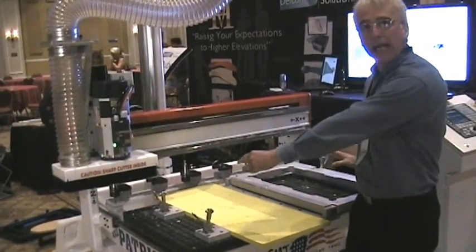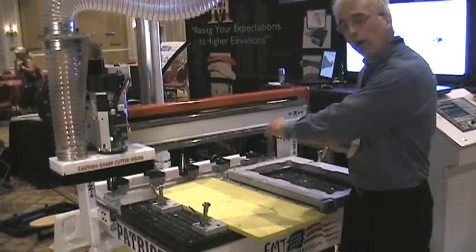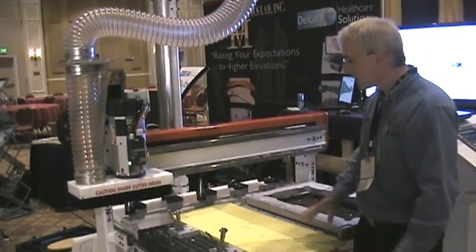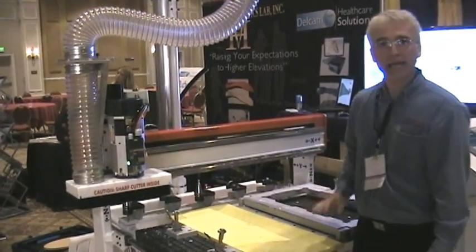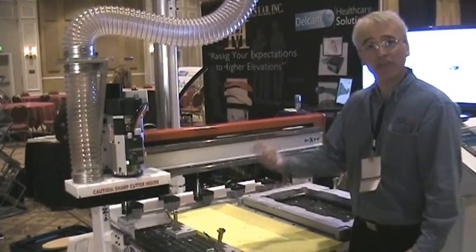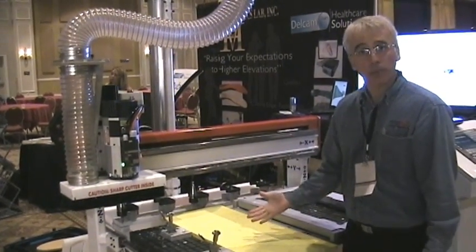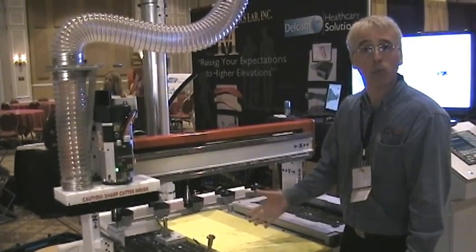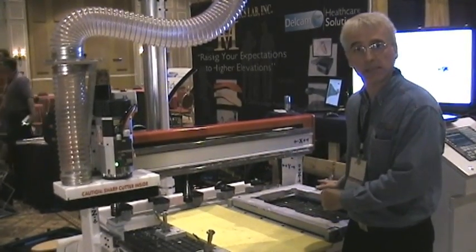We call this our ortho-table system, which is designed and set up for cutting EVA material, for cutting hard plastics material. We can cut MDF and LDF, and also foam materials — six-pound density foams, et cetera — for cutting foot positives. So a real complete system here.